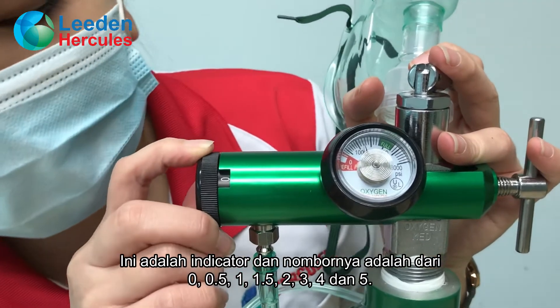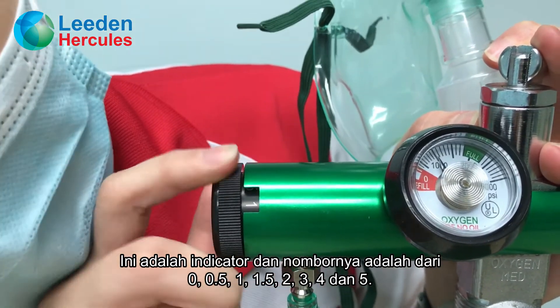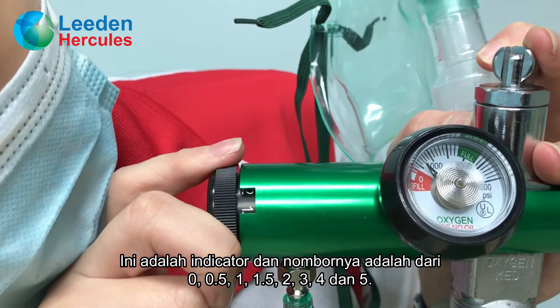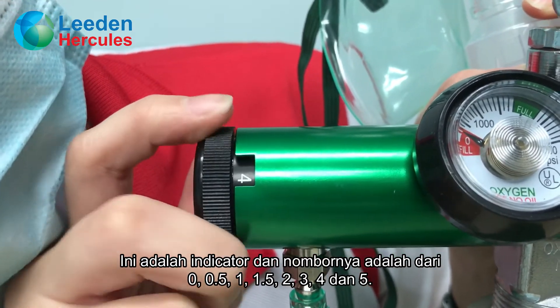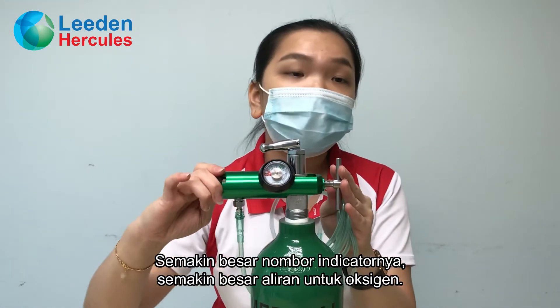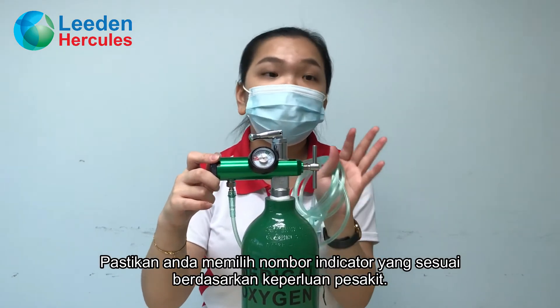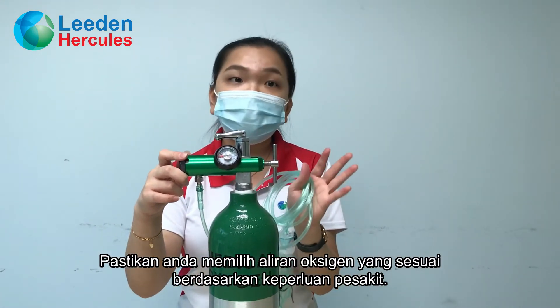The indicator numbers go from 0, 0.5, 1, 1.5, 2, 3, 4, and 5. The bigger the number on the indicator, the greater the flow rate of the oxygen gas. Please choose the suitable rate of oxygen flow based on the patient's needs.